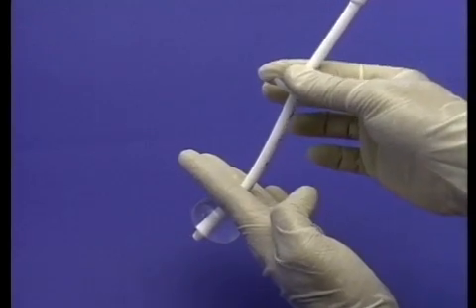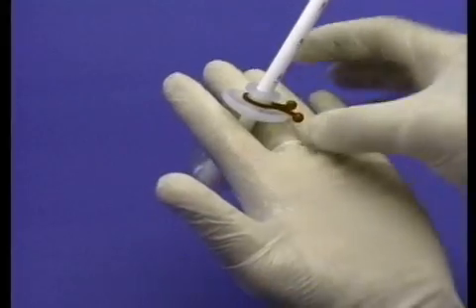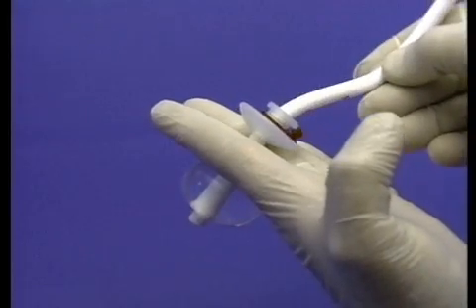Slide the pivotal bolster down the shaft of the tube until the bolster gently rests on the abdominal wall, being careful to avoid excessive tension. Secure the twist lock around the bolster.